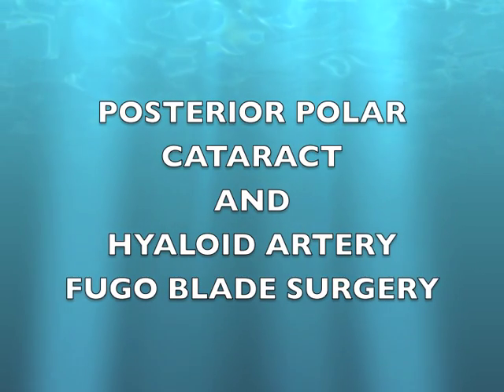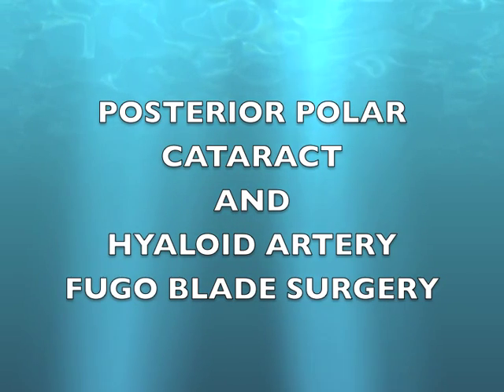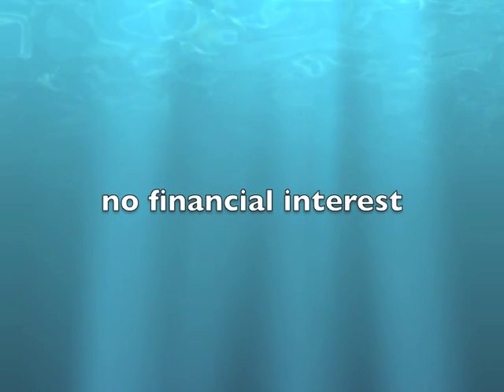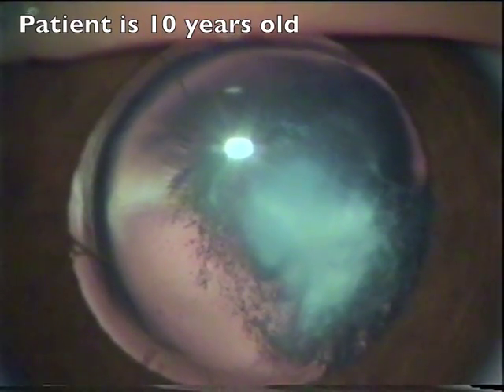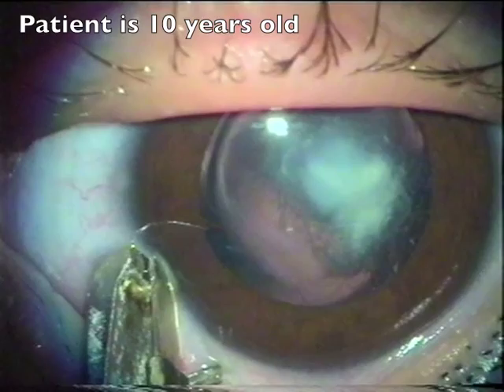Posterior Polar Cataract and Hyaloid Artery surgery, done with Fugo blade. This surgery was done long time back in 2002. The patient was 10 years old. That's how the cataract looked.